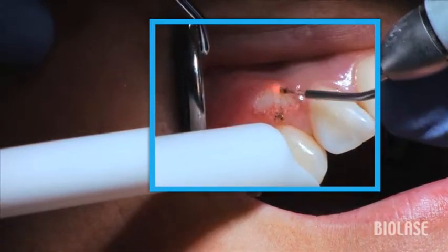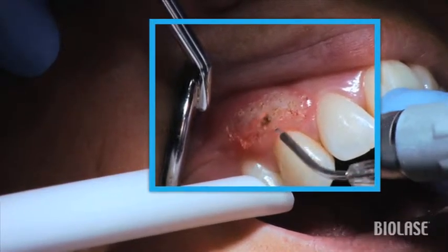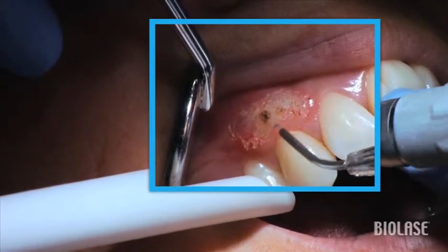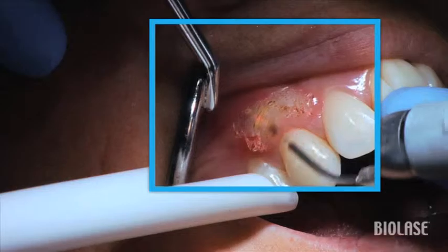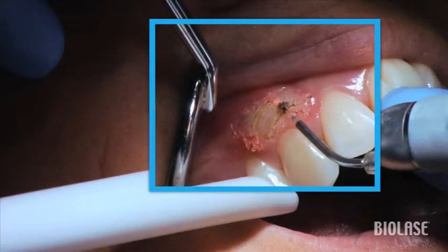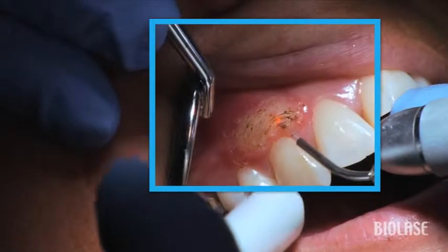In a patient with excessive gum tissue covering the teeth, you would expose the teeth holding the tip perpendicular to the tissue, and then thin the thick tissue holding the tip parallel to the tissue. In cases like this that only require thinning the tissue, hold the 400 micron tip parallel to the tissue and decrease the gingivectomy preset by 0.3 watts from an initial setting of 1 watt.